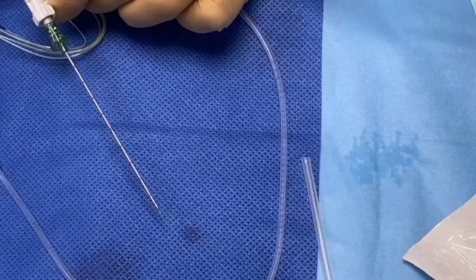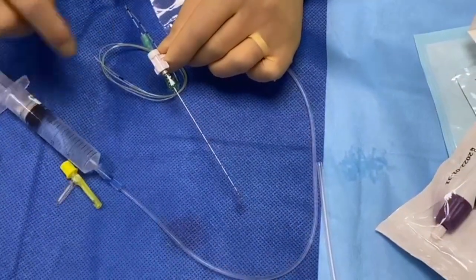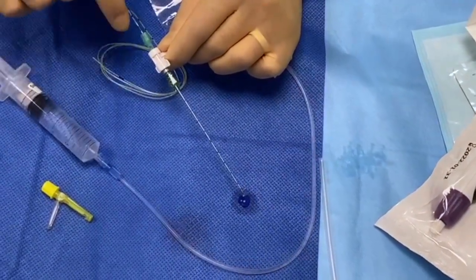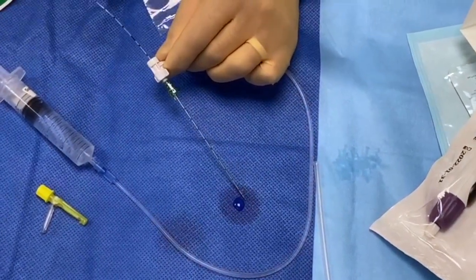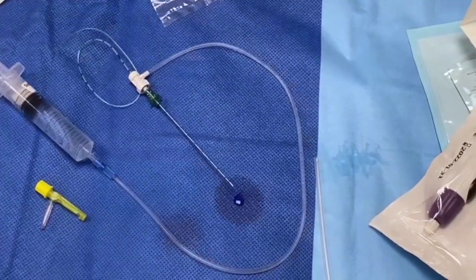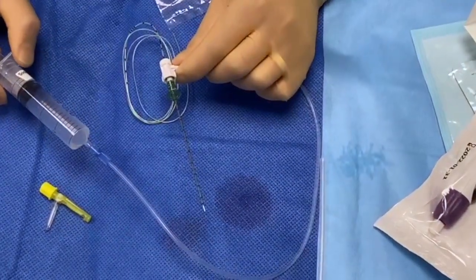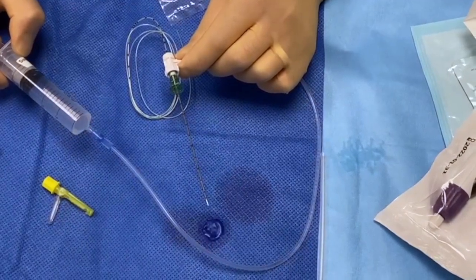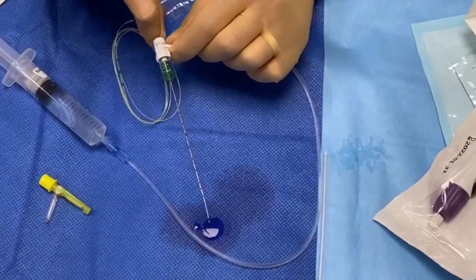I'm going to bring the catheter back a bit. At this point, if I inject via the giving set with the green connection attached, the local anaesthetic — although it comes out the end of the needle — will also come out the back. So at this point you can dislodge that green connection and remove it out of the way. You now have a needle loaded with a catheter and giving set connected, and you can administer local anaesthetic that comes out the end of the needle. When you need to place the catheter, simply advance and it's ready to go.